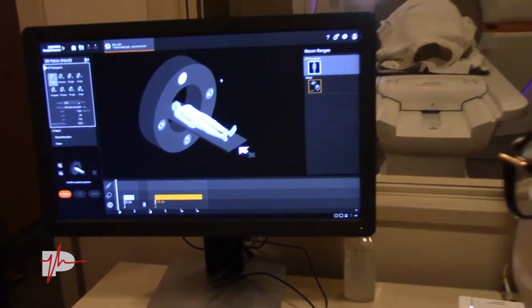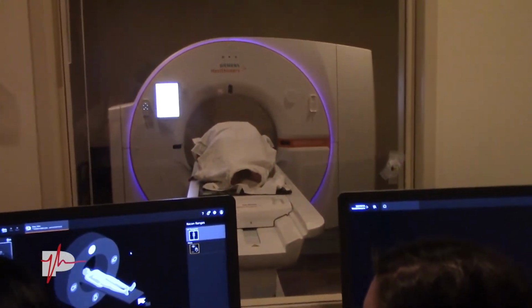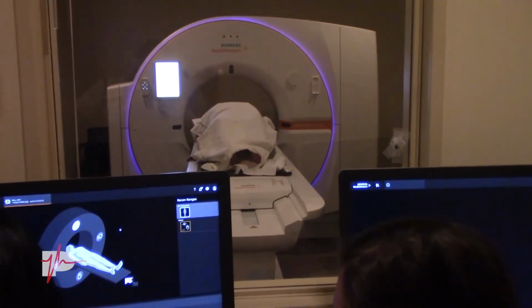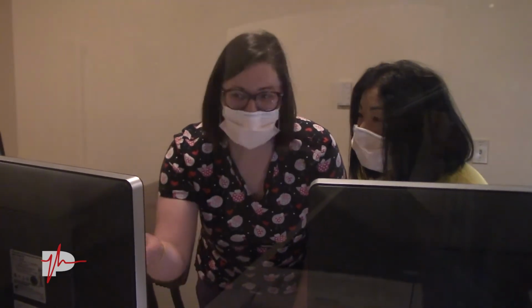How do these changes in the new scanner benefit the patient? Actually, it decreases the scan time because they're more comfortable. We're not having to change the positions and get them in a more comfy spot. They're kind of laying there relaxing, and so it's a faster scan time. We're not having to go back and adjust things. When we're utilizing the 4D scanner, it helps accommodate the breathing cycle for the motion management scans that we need.